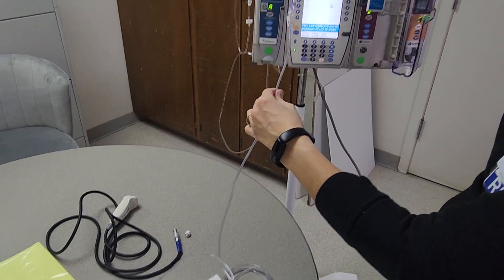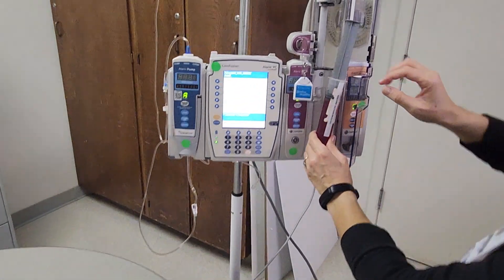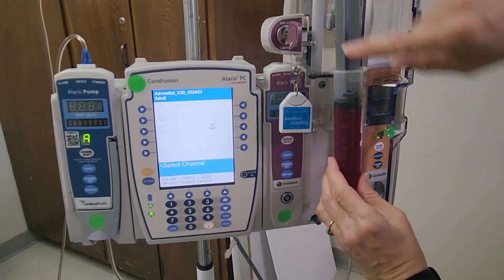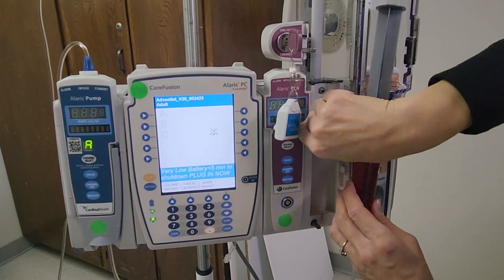Make the connection and then go ahead and place the syringe into the pump. Make sure that when you place it, you place it optimally so that you can see the markings on the syringe as well as the medication label.